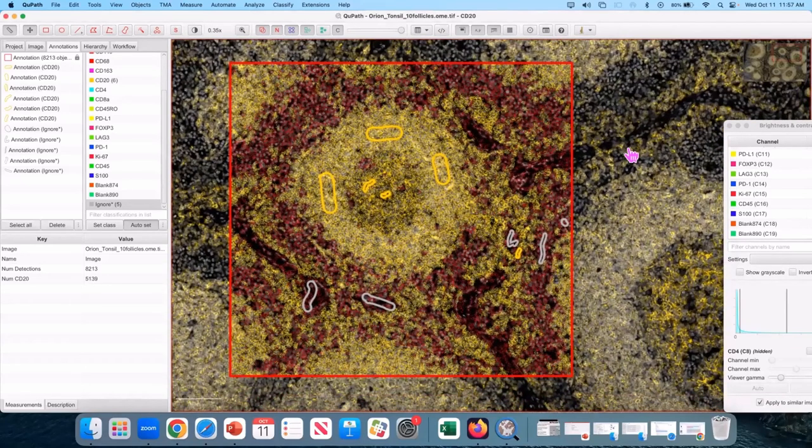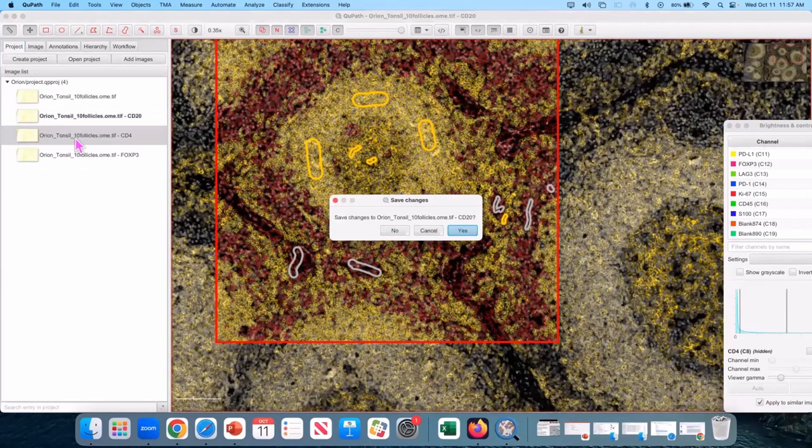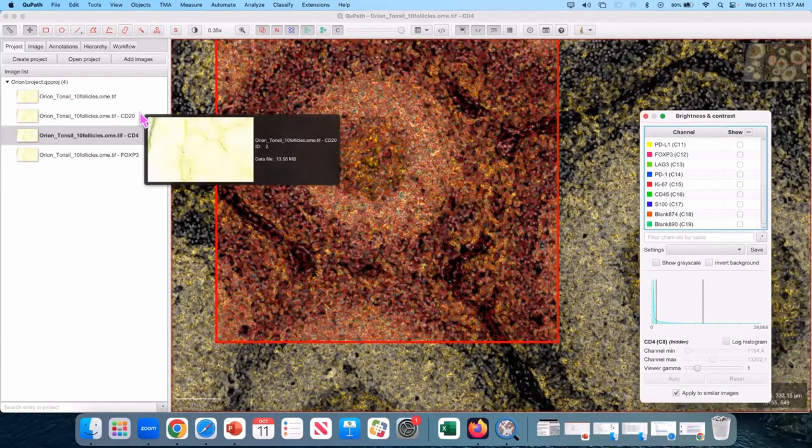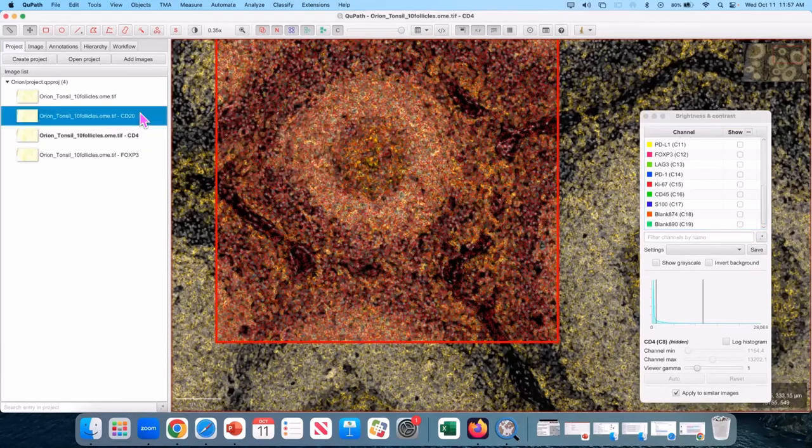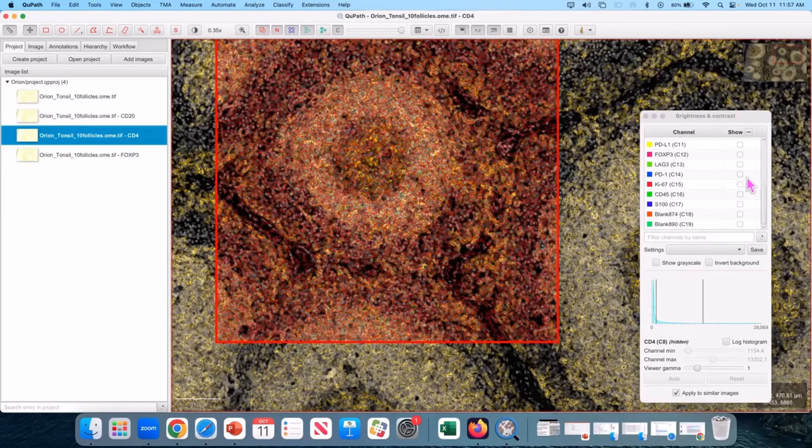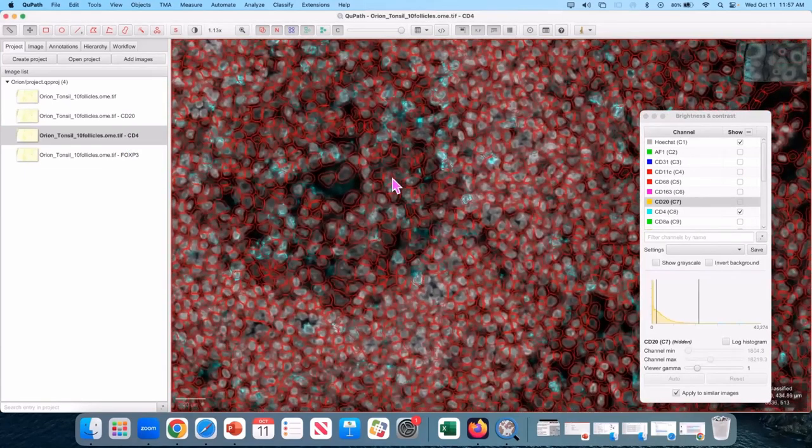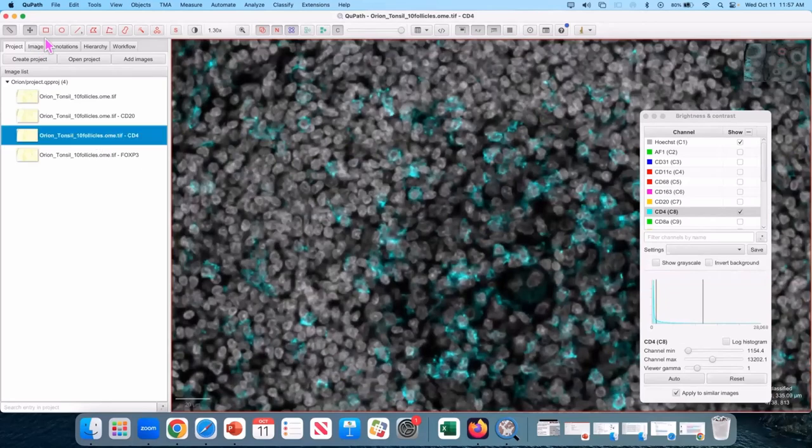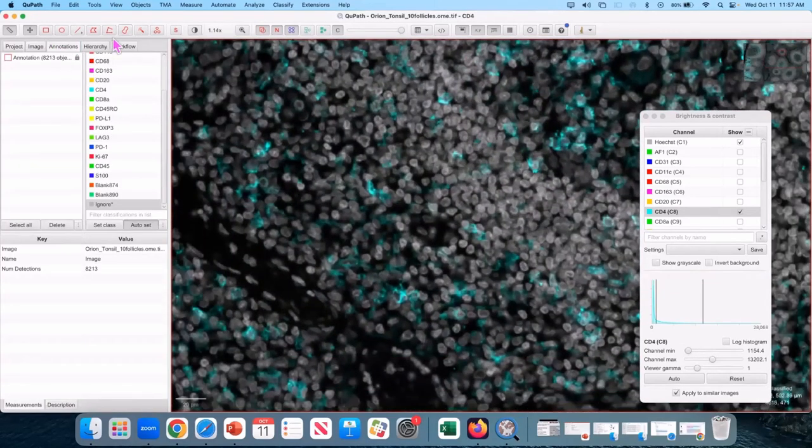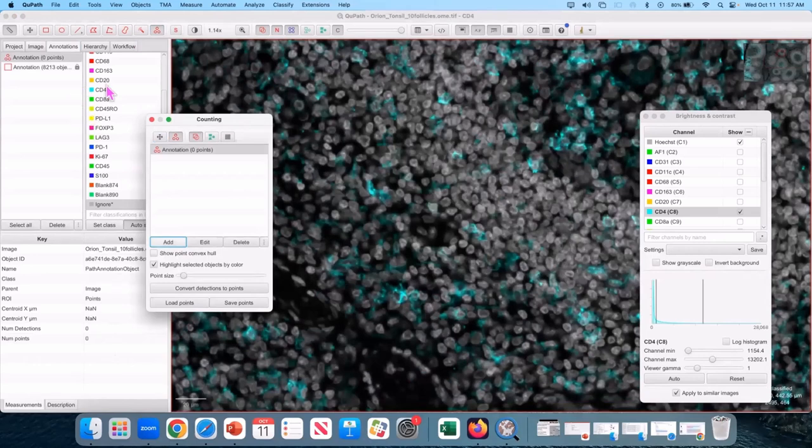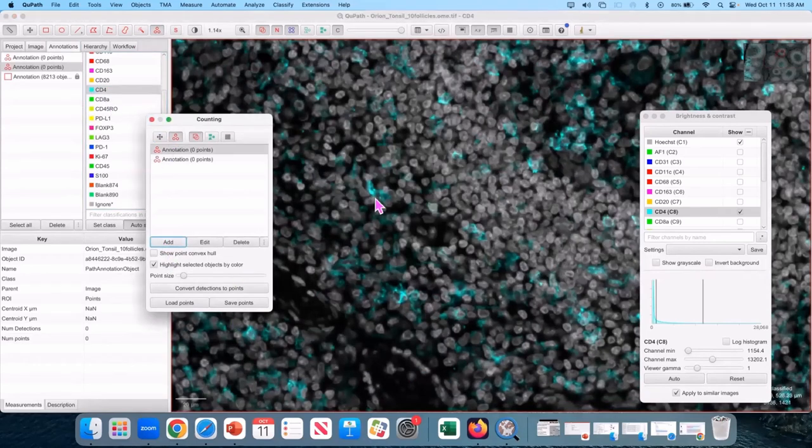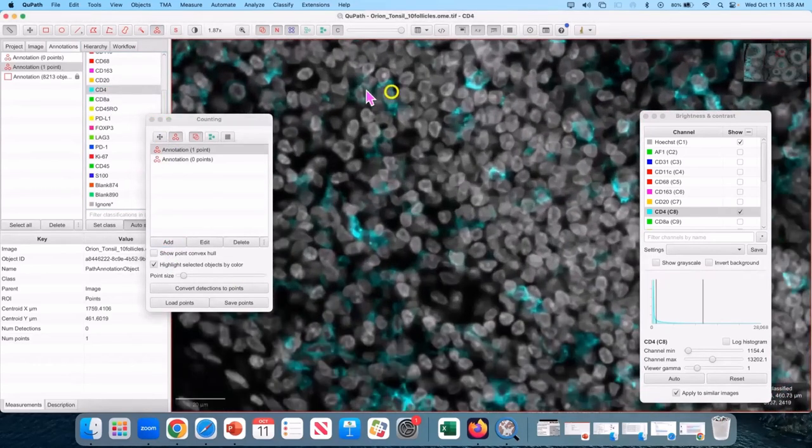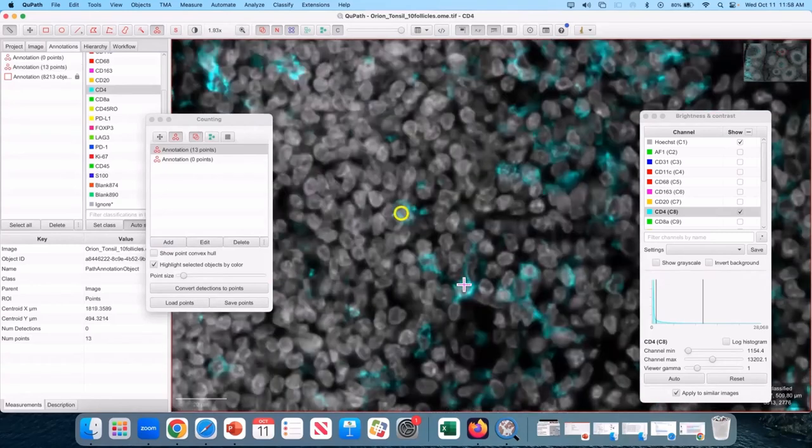How many people have gotten to this point? Then we're going to move on to CD4. So I saved my training data in the one labeled CD20. I've moved on to a new clean image. It still have all the cells. And then I can scroll back up and do this one. For this one, because the CD4s are kind of scattered, I'm going to use the points. Add. First class is CD4. Then click, click, click.